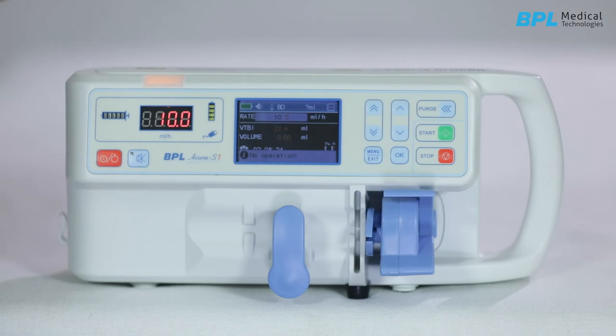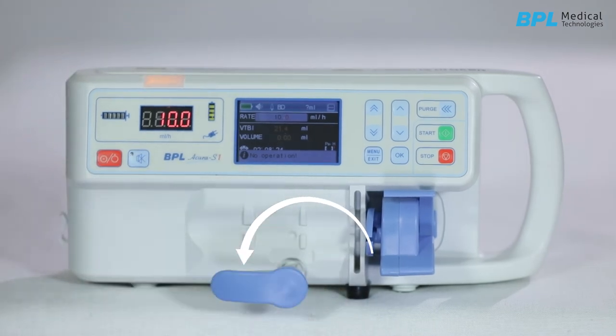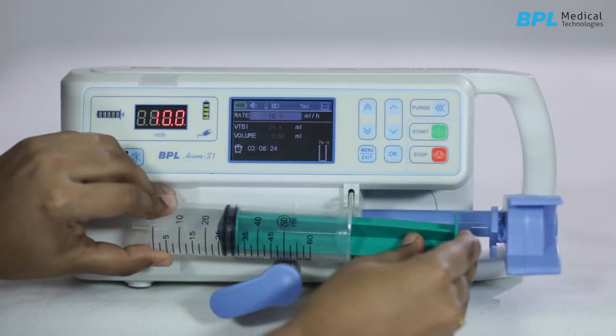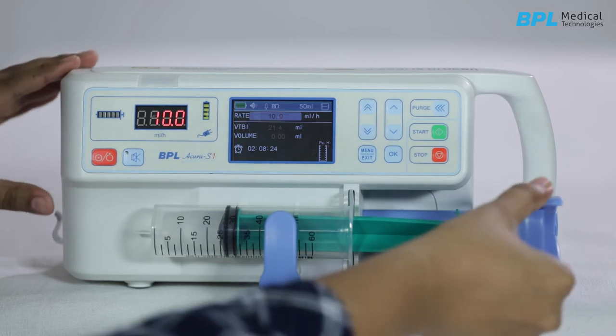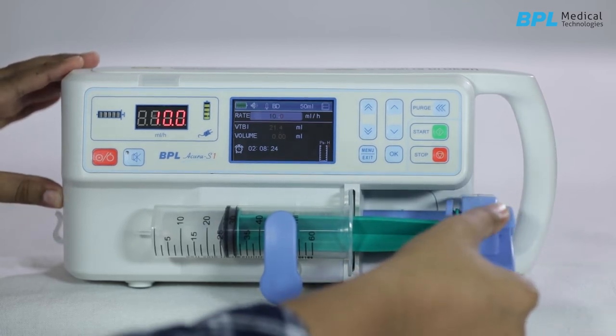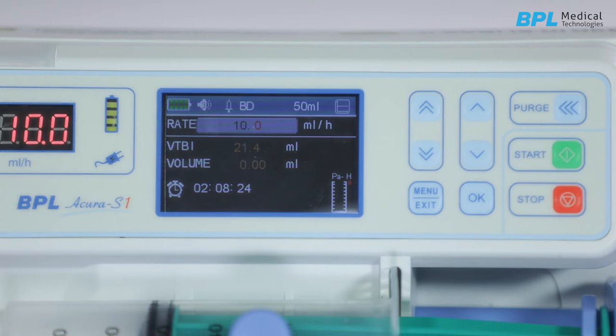Pull out the syringe clamp and turn it counter-clockwise by 90 degrees. Place the syringe in its cradle and the flanges correctly into the provided slot. Turn the syringe clamp clockwise by 90 degrees and press the syringe. Press the finger grips and slide the mechanism to the left until it reaches the plunger head. Release the finger grips to make sure the plunger grippers are holding the plunger in place.